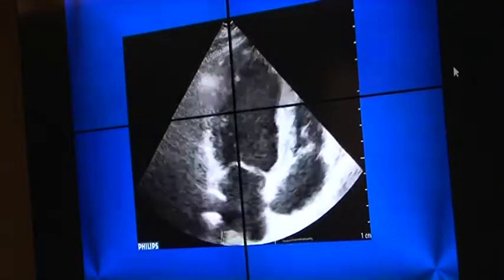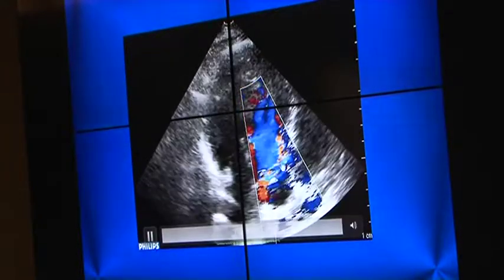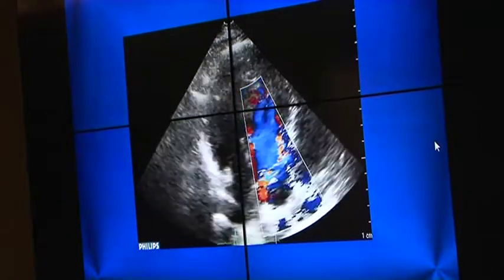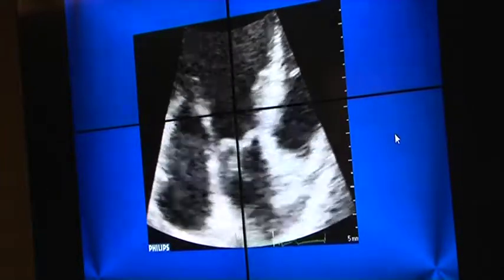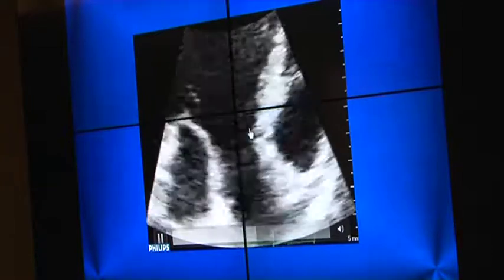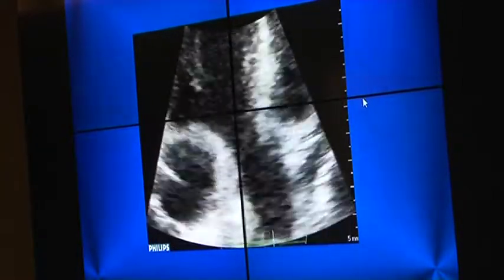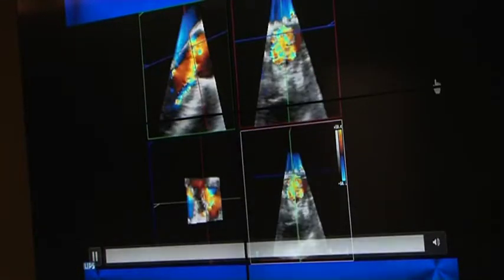And what about aortic regurgitation? This is a nicely remodeled ventricle, with what we very often see, that the regurgitant jet is very, very eccentric and very difficult to analyze with 2D echo. So in that case, I enlarged and zoomed in on the valve, but it was not 100% easy to define what the main pathology is. So I acquired 3D color loops.